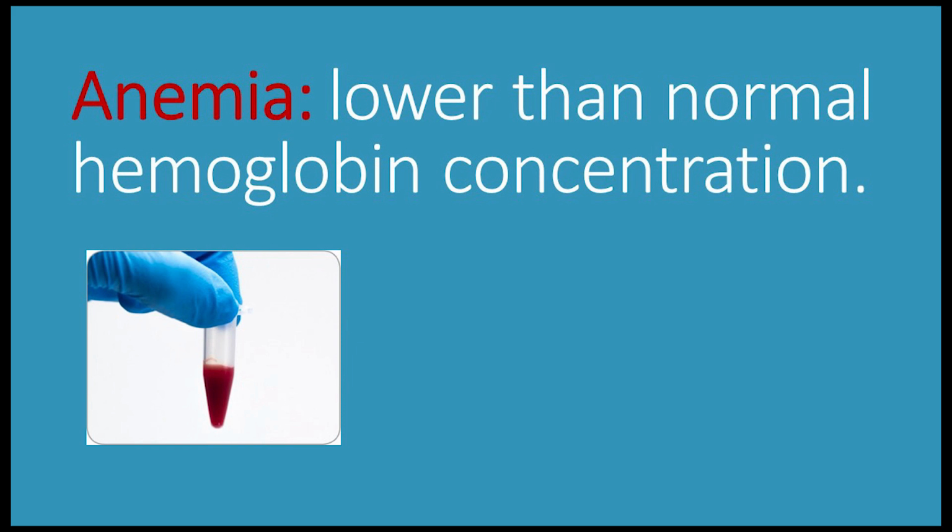Now we're going to apply what we've learned to today's lab. In today's lab, you are investigating the causes of anemia. Anemia is defined by having a hemoglobin concentration that is too low for that sample of blood.